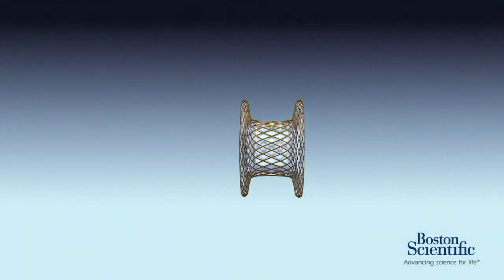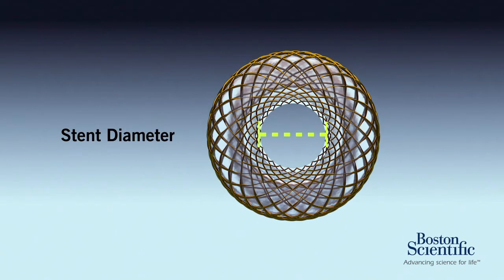The stent is available in two sizes, 10 mm by 10 mm and 15 mm by 10 mm. The stent length is measured between the two stent anchors. The Axio Stent has a large lumen diameter designed to optimize drainage.